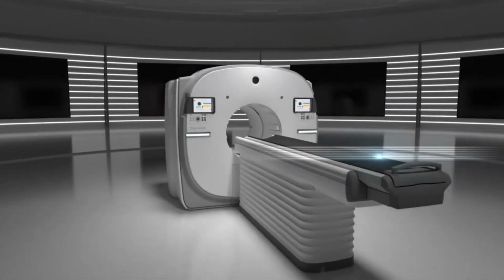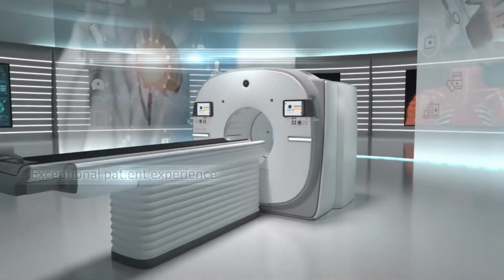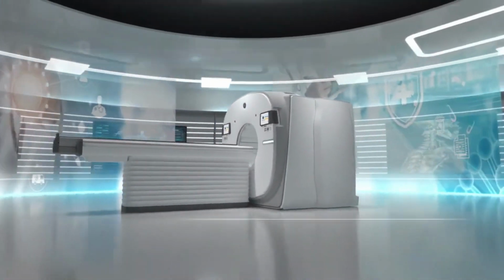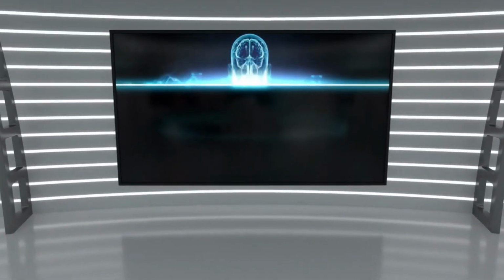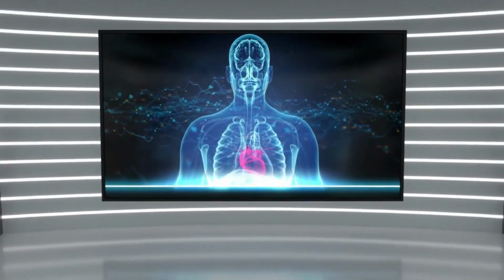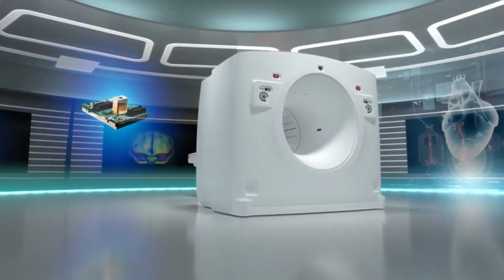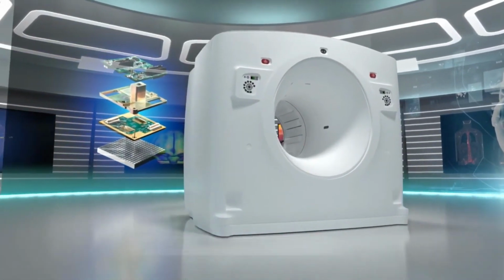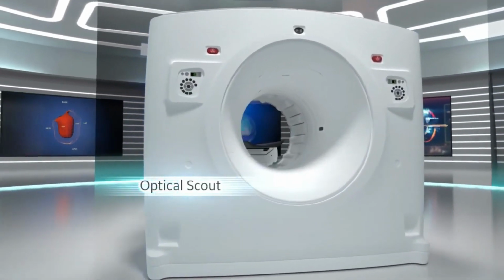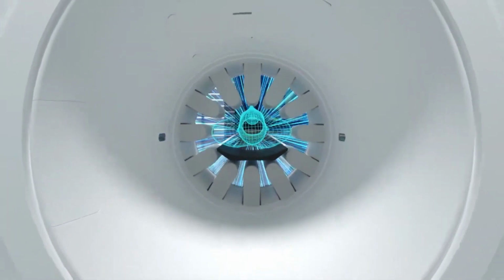SPECT is a nuclear imaging scan that integrates computed tomography, CT, and a radioactive tracer. The tracer is what allows doctors to see how blood flows to tissues and organs. Before the SPECT scan, a tracer is injected into your bloodstream. The tracer is radio-labeled, meaning it emits gamma rays that can be detected by the CT scanner. The computer collects the information emitted by the gamma rays and displays it on the CT cross-sections. These cross-sections can be added back together to form a 3D image of your brain.